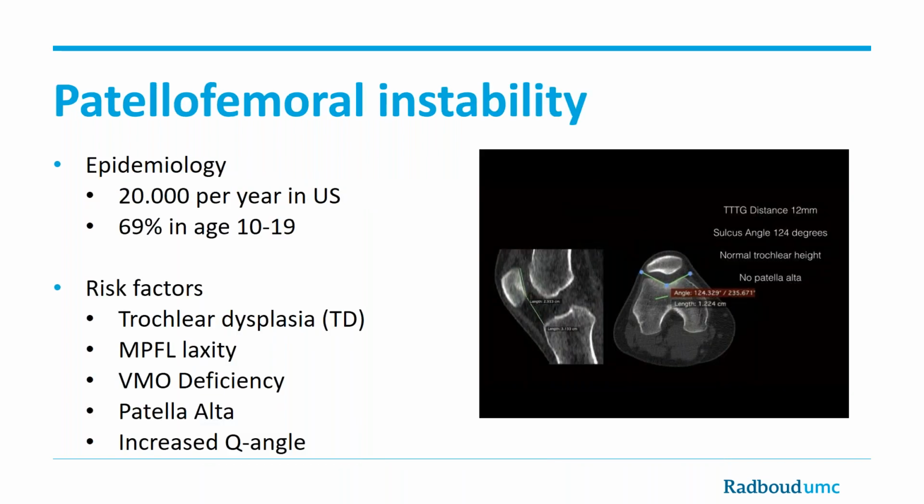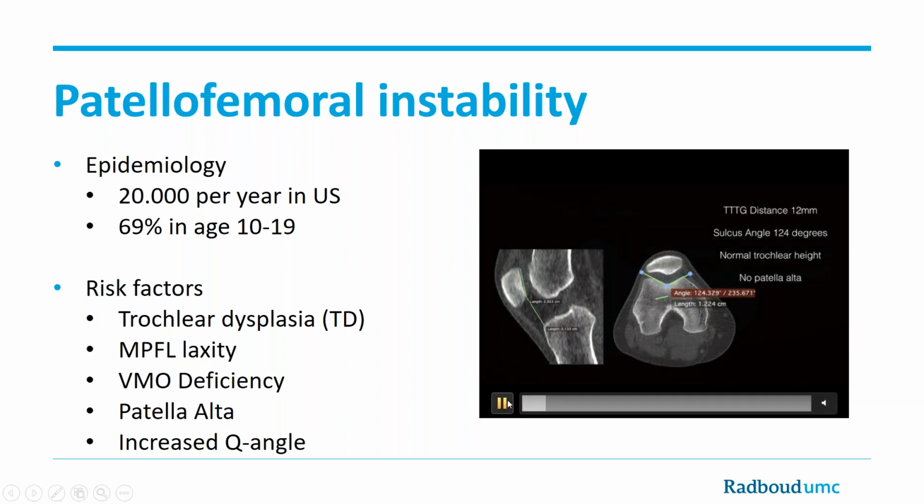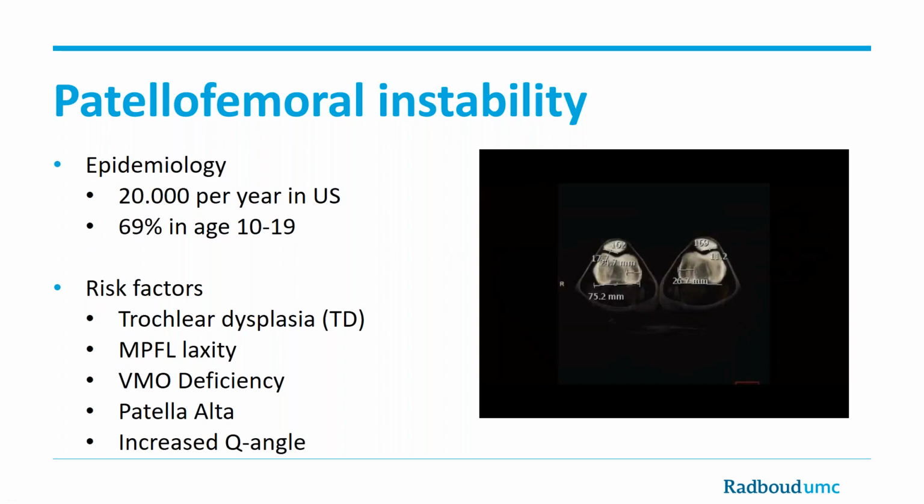So this brings me to the last topic of today, which is related to patellofemoral instability. This is a quite common problem in the young and very young population. To give an idea, I have a video here which shows a dynamic CT scan of a patient with patellofemoral problems. You can appreciate that the patella is subluxating to a very large extent, which causes discomfort in the patient.